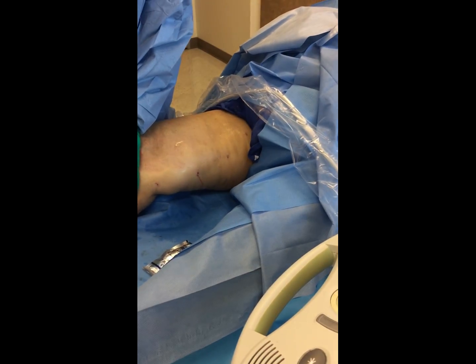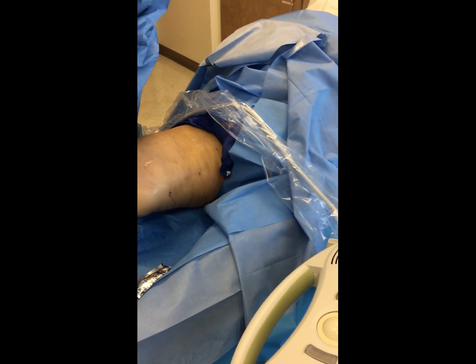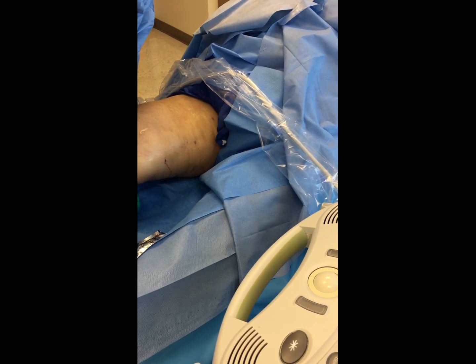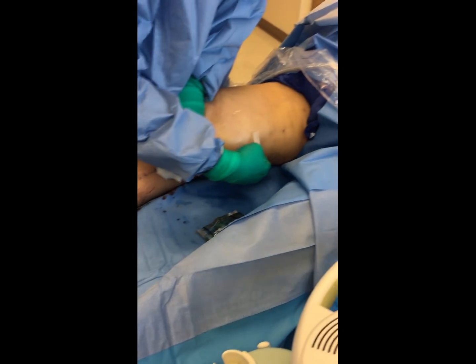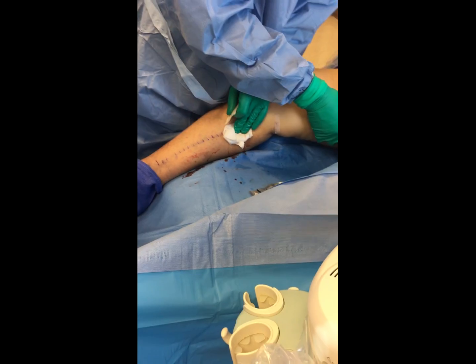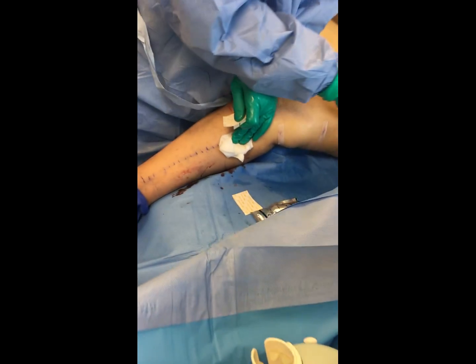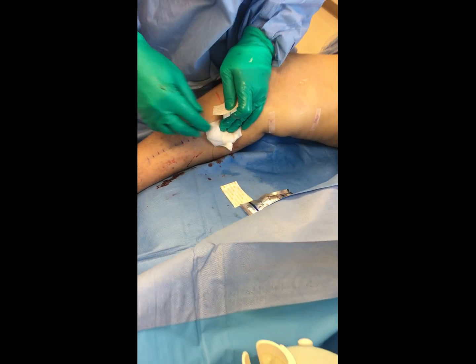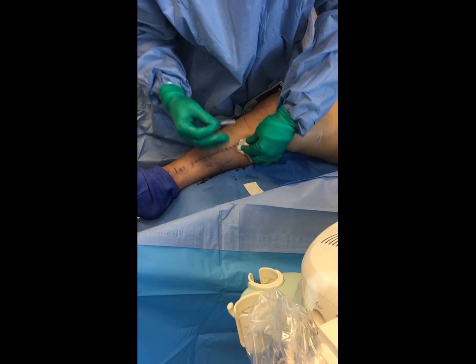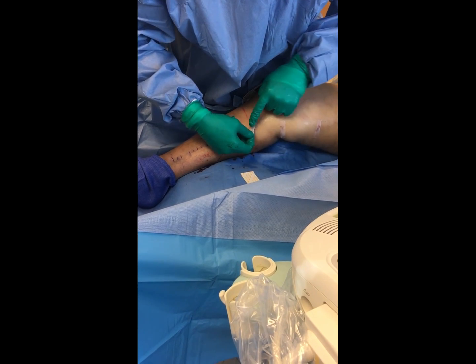How was that? Did it hurt? She didn't find it to be real painful — just a little. Her knee hurt because of her arthritis, not even from me. They're going to wrap the patient up. That was it.